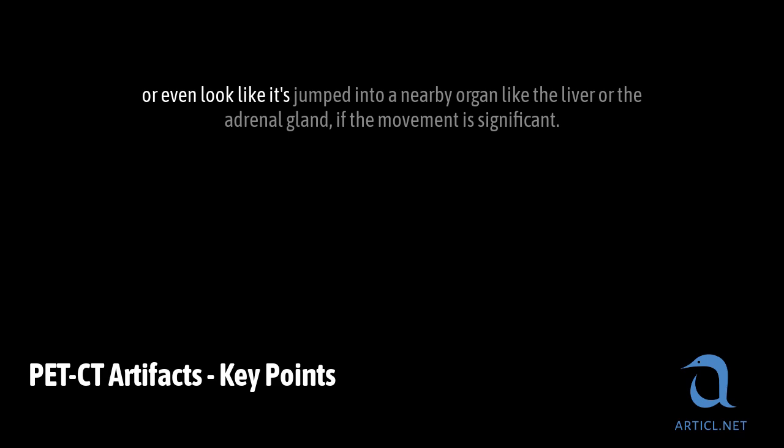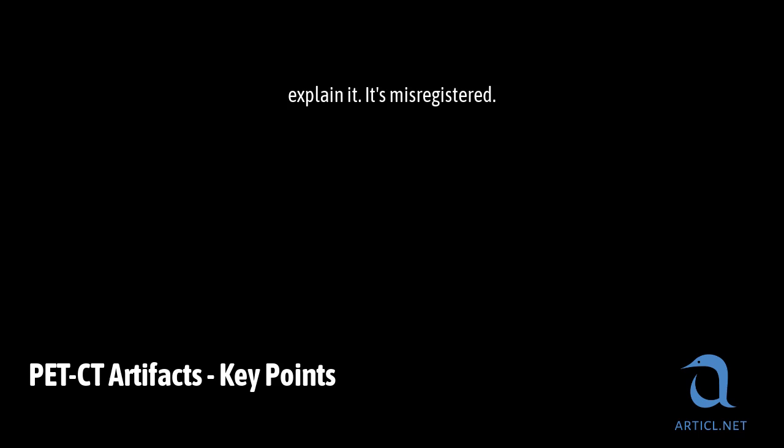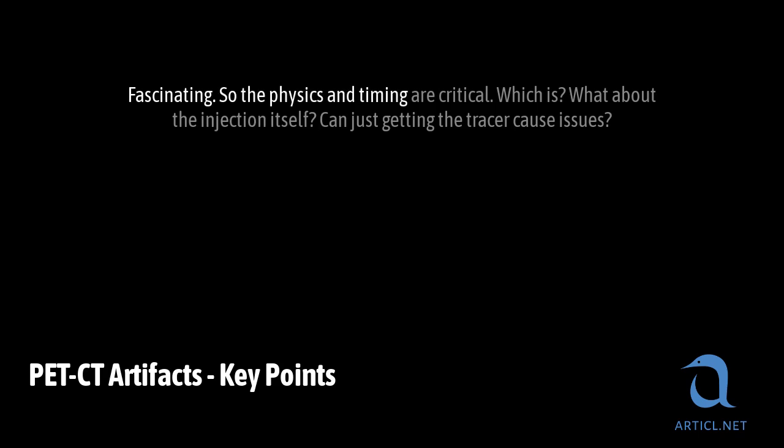Or even look like it's jumped into a nearby organ, like the liver or the adrenal gland, if the movement is significant. Whoa. Yeah, it creates this puzzle, because you might see a PET hotspot, but when you look closely at the CT, there's no actual lesion or structure right there to explain it. It's misregistered. Fascinating. So the physics and timing are critical.